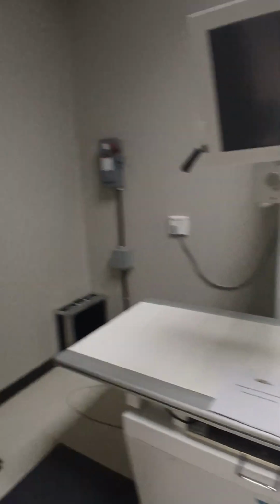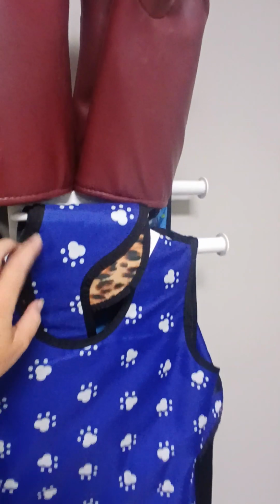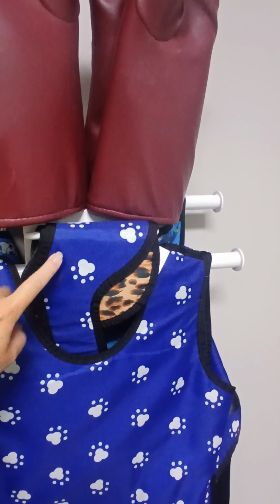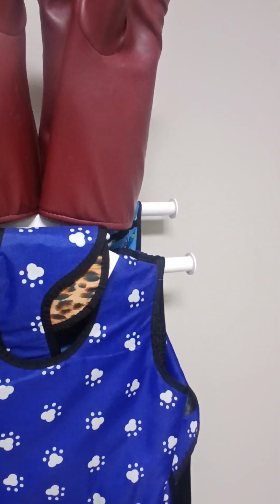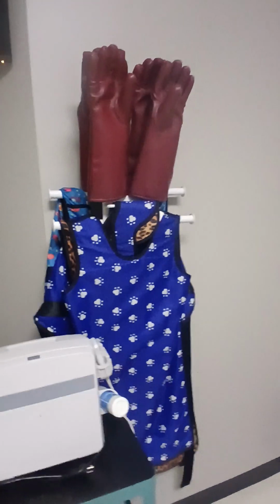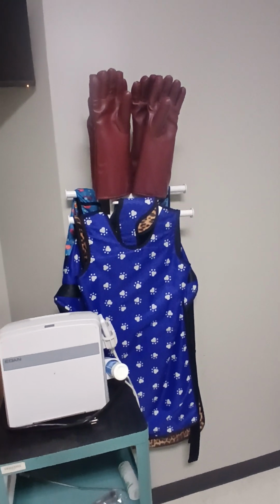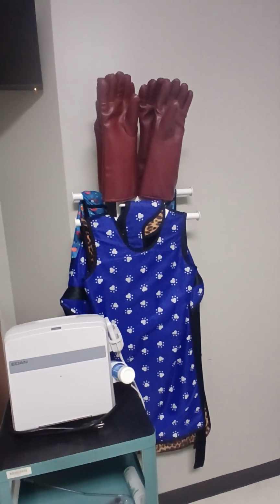Another real quick thing to point out is your lead gowns. So we have our lead gowns, our thyroid shields, and then our gloves. And we're going to clip our dosimeter badge just at the bottom of the thyroid shield. This equipment is not optional. You have to wear your gown, thyroid shield, and gloves when you're taking x-rays. Another real quick thing, the x-ray log, we will be logging every single x-ray we take. That's a law, we have to do it.